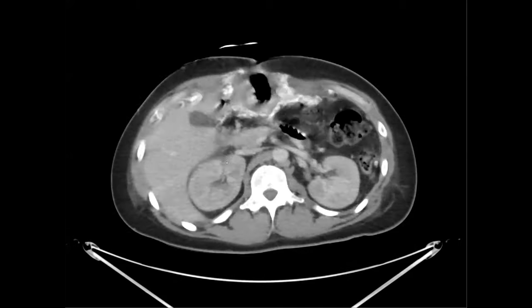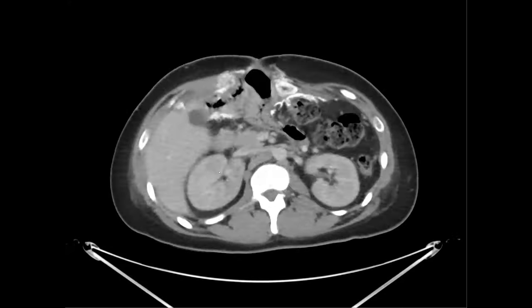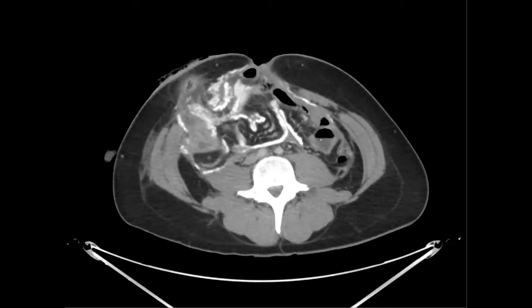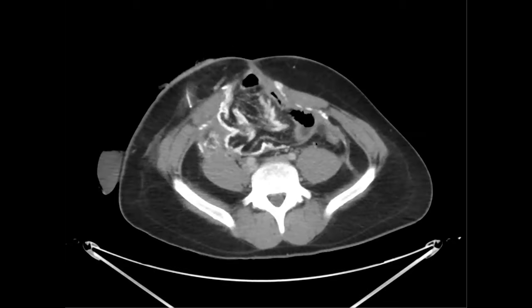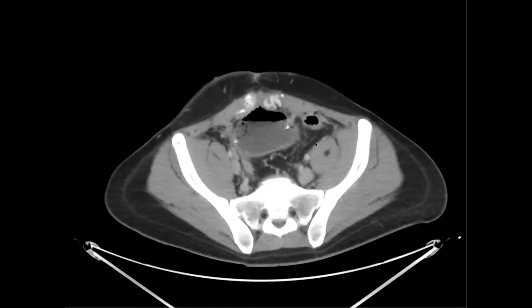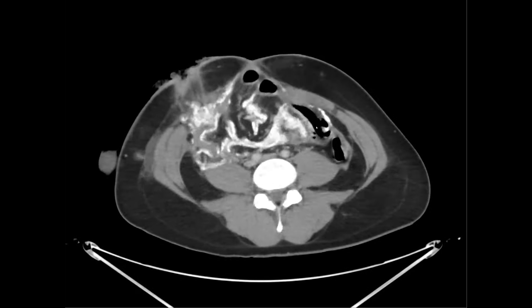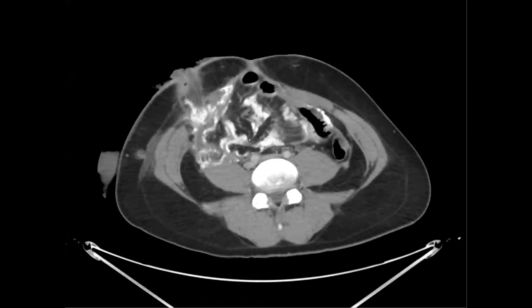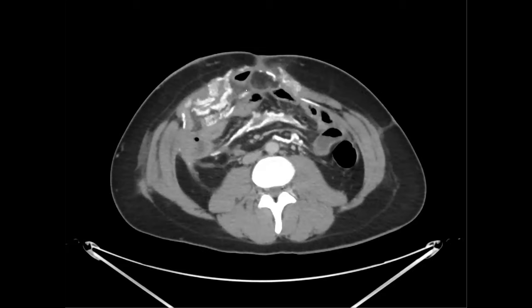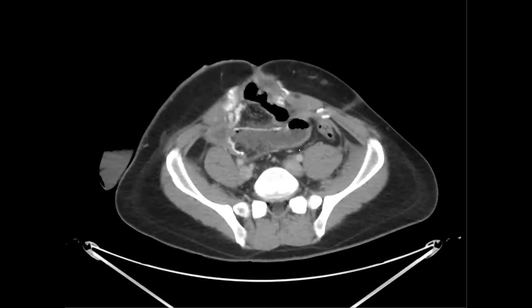Okay, so this is a case of a patient who had trauma and had multiple surgeries. Just wondering what you think about the abdomen here. Is it all calcified there? It's very calcified and kind of linear. It's along what looks like the peritoneum and in the mesentery, but kind of on the visceral peritoneal lining.